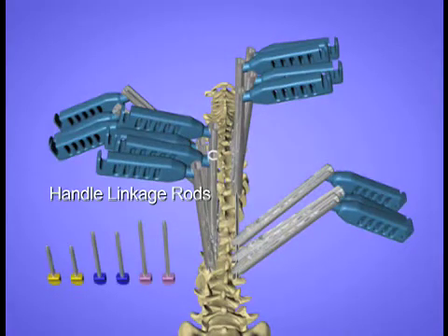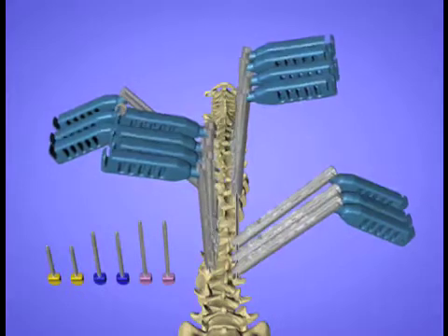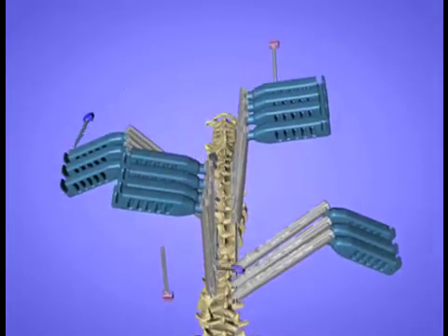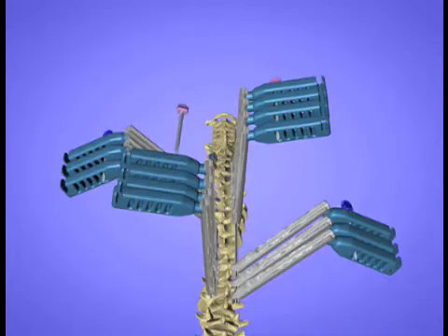The slots in the handles of the derotators are aligned manually. A handle linkage rod slides through the innermost set of slots in the handles.